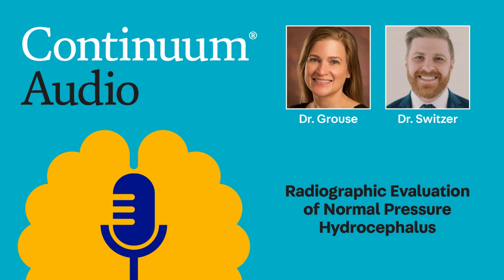Because we know that in idiopathic normal pressure hydrocephalus, especially in the DESH phenotype, the ventricles can become larger and the effacement of the sulci at the convexity can become more striking over time. And this could be a helpful tool to identify how long that's been there and if it fits with the clinical history. So that's something that I find very helpful.